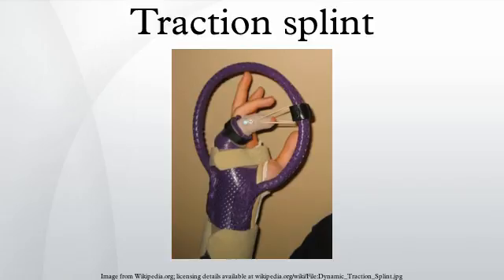The Sager splint is an innovative splint that has introduced a new concept in the fixation of the femur. It consists of a metallic splint that is placed between the patient's legs. Some models may be placed on the side closest to the injury for bilateral femur fractures without pelvic trauma. Straps are then applied, first at the thigh and then at the ankle, to strap the injured leg to the pole and provide support. The pole is extended to supply the needed traction, and then both legs are wrapped with cravat-like straps.